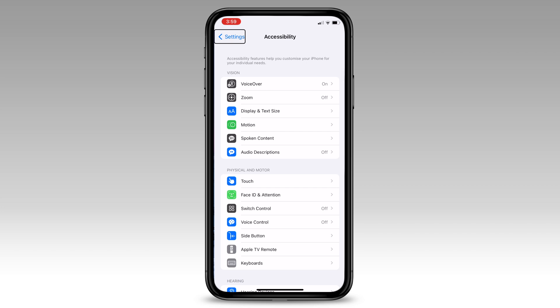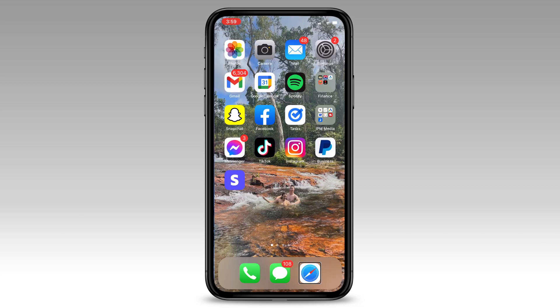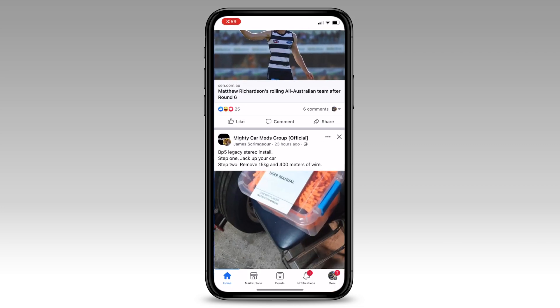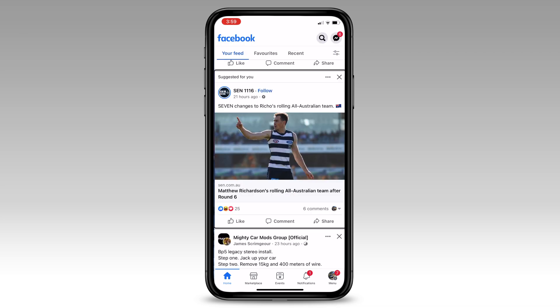Here's an example of how it sounds when you select an item. Facebook double tap suggested for you more options hide SEN1116 dot follow 21 hours ago custom seven changes to Richo's rolling all Australian team flag of Australia, Matthew Richardson's rolling all Australian team after round six send.com.